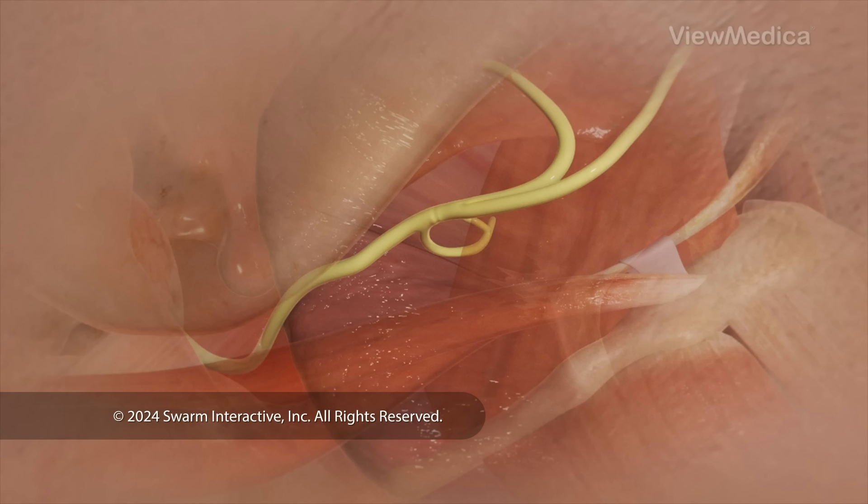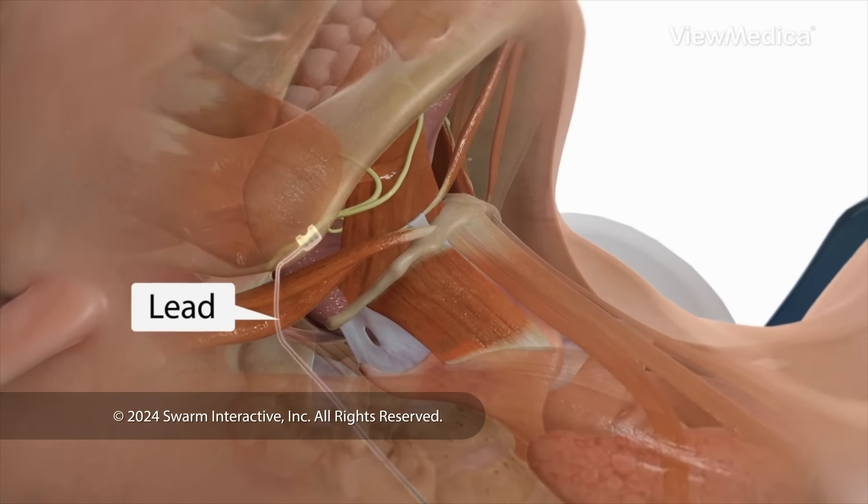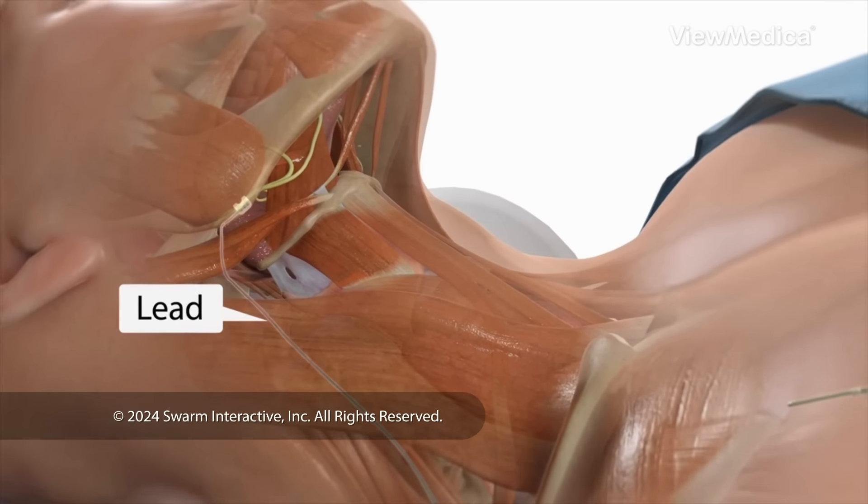Now, we implant the first part of the device. It's a small electrode that goes around the hypoglossal nerve. The electrode is attached to a thin wire called a lead, which goes under the skin of your neck and down to your chest.